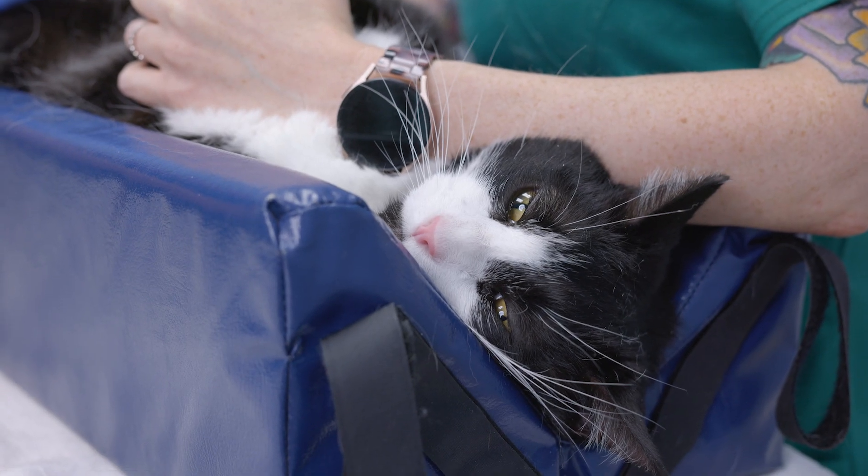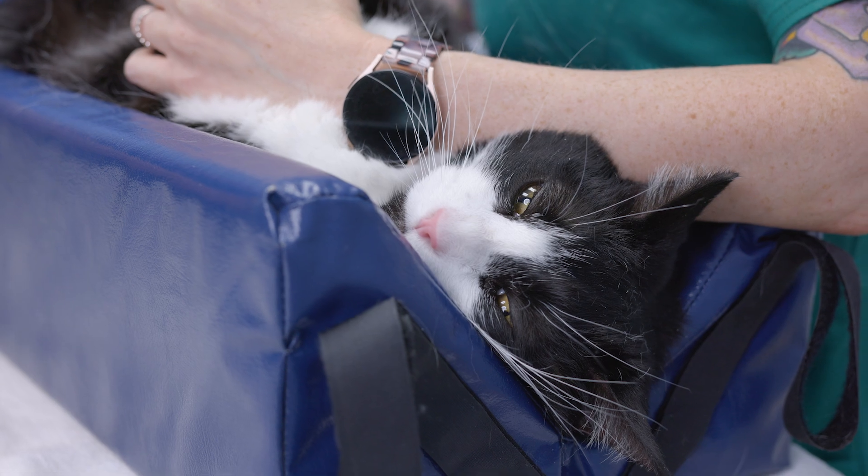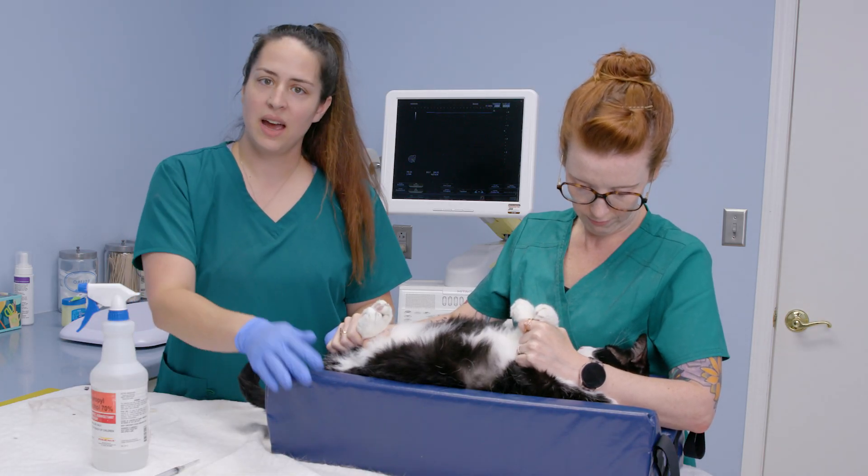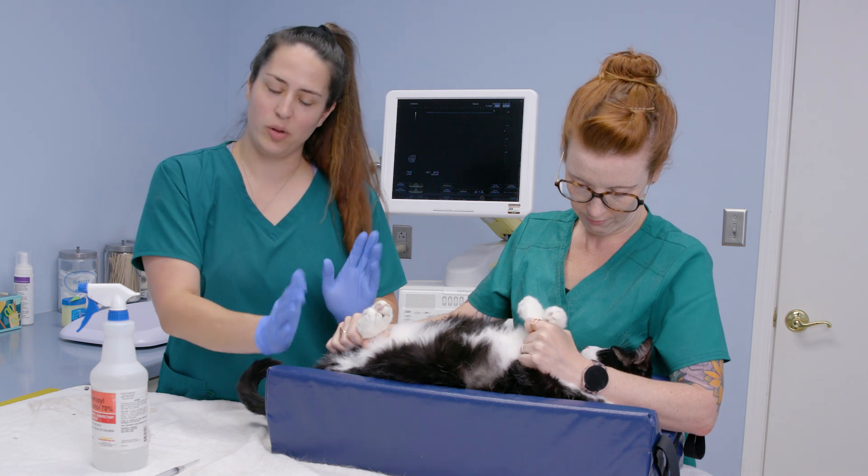We want our patient to be in dorsal recumbency and something comfortable, whether it's a trough that has some cushion like this or a trough that has a blanket, something that kind of helps keep them stable in that position.